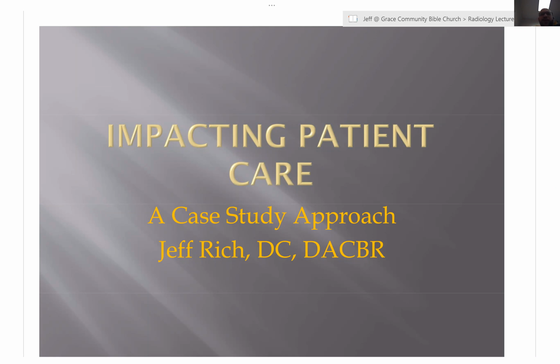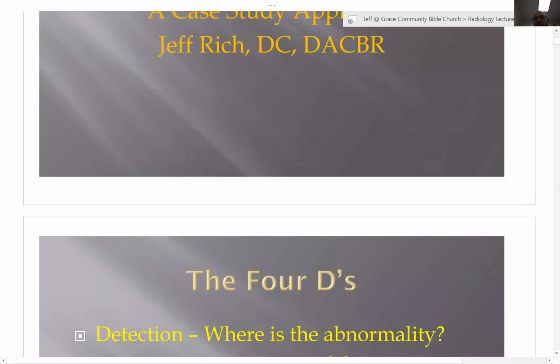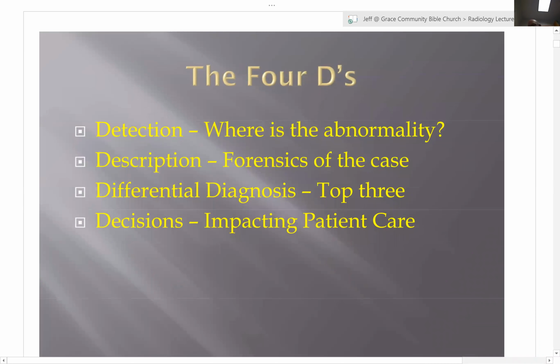What I want to show you is some case studies and have you actually participate in those radiology case studies and practice going through the approach of doing radiology. And what I mean by doing radiology is the 4 Ds. I teach one class at Northwestern these days. It's a fun class. It's for the trimester 9 students. It's all case studies. And we go through this process of radiology.